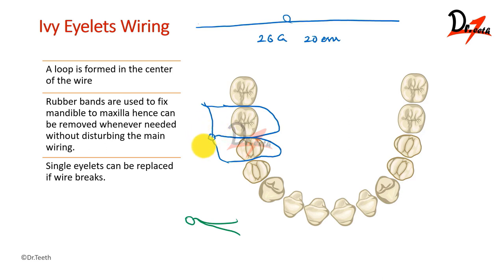Let us revise. We made an eyelet first, we inserted the ends interdentally between the two teeth, and we are forming a W shape. One end is going from the mesial side of the tooth and the other end is going out from the distal side of the tooth, and this will go inside the eyelet and we are going to twist it — not very tightly, because first we have to establish the occlusion. Rubber bands are used to fix the mandible to the maxilla. We did the upper arch, we did the lower arch, we established the occlusion, and we use rubber bands to fix the mandible to the maxilla. Whenever we need to remove it, we can easily do so because we have the rubber band there.